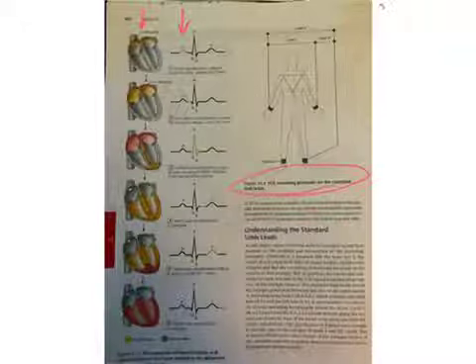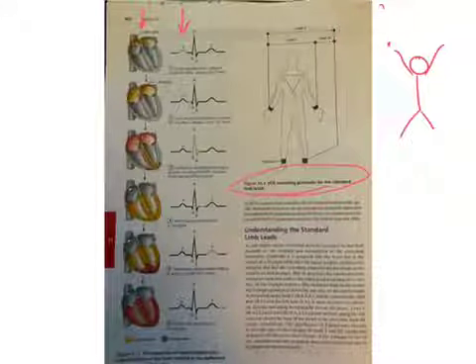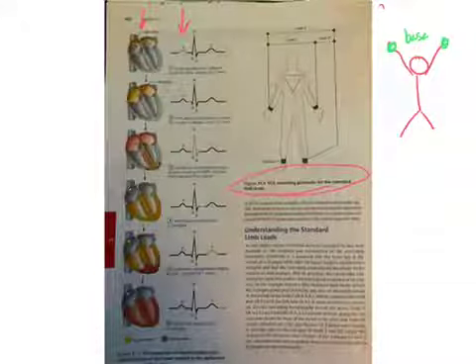So when we look at what happens, these are called limb leads. These are electrodes at very, very certain positions. So you are required to know where the limb leads are for the first 3 leads. When we look at lead 1, it's going to be on the right arm and left arm. I have students who do like this YMCA thing. So we're going to have right arm and left arm for where lead 1 would record. And this is recording across what's known as the base of the heart. So it makes sense that with both arms it would be the atrial electrical activity.